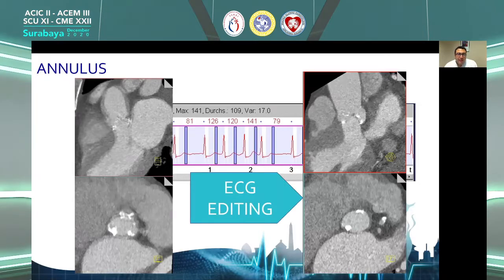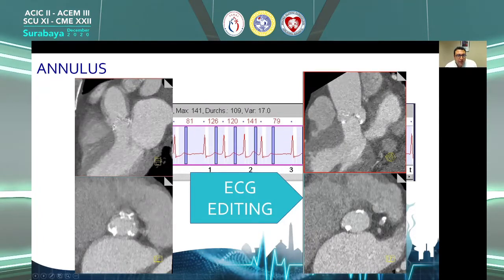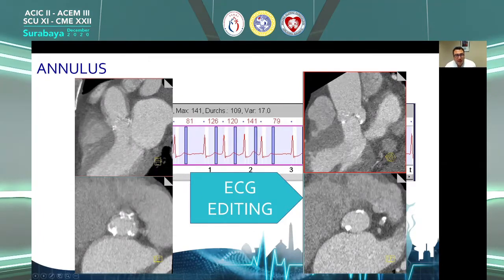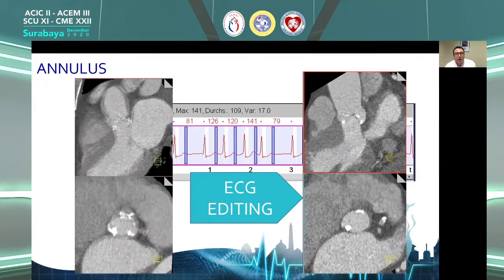We have to be aware that these patients not uncommonly have rhythm issues. In a patient with atrial fibrillation without any ECG editing, you can see double contours around the annulus — you simply cannot size the annular plane because you have no clear idea where the annulus starts or ends. You can edit the ECG, and in the exact same patient with retrospective ECG gating or prospective gating with a wide window, which allows you to change the time point of image acquisition, you can get very nice images with precise annular detail and then start measurement.